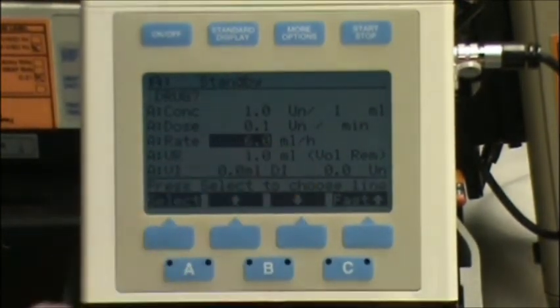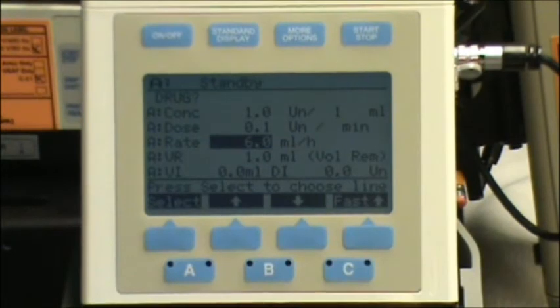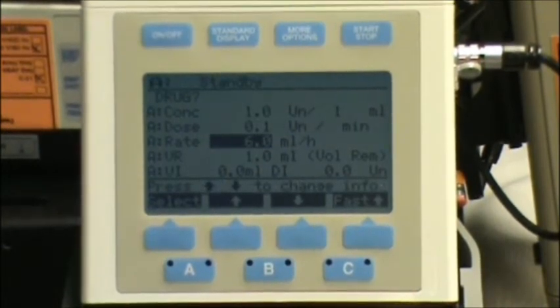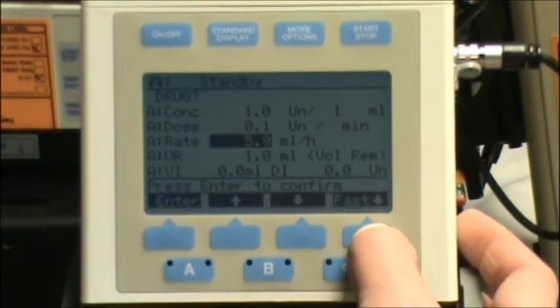but I'm just going to fast forward to where I put my rate in, milliliters per hour. Now I have memorized that a 1 to 1 concentration of vasopressin for a dose of .04 units a minute comes out to 2.4 mLs an hour. So I'm going to put in 2.4.